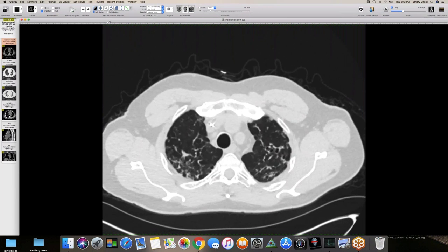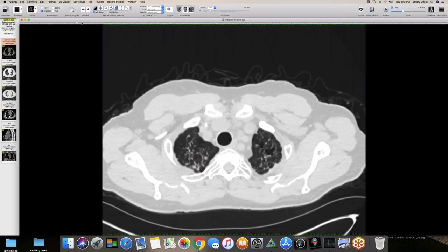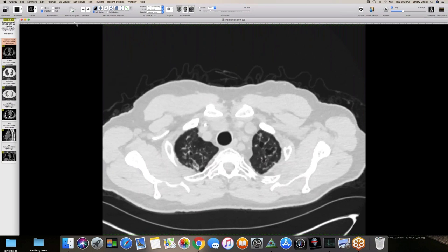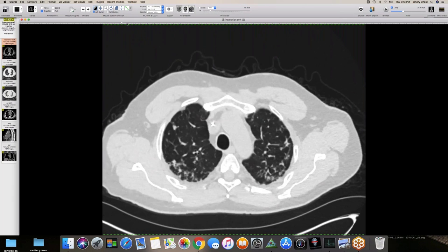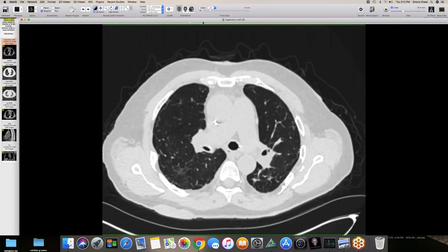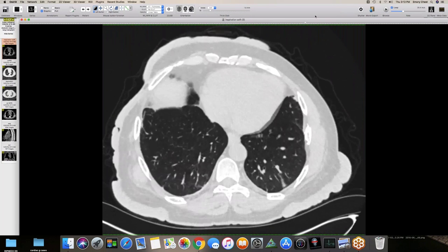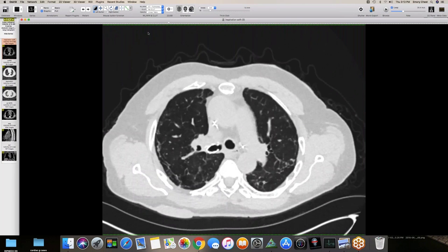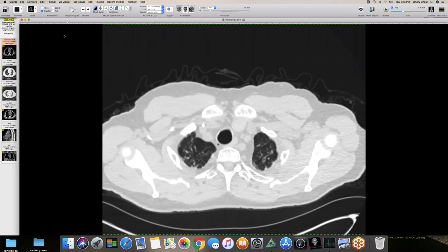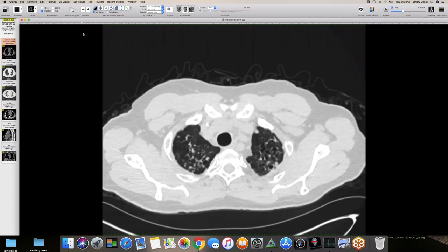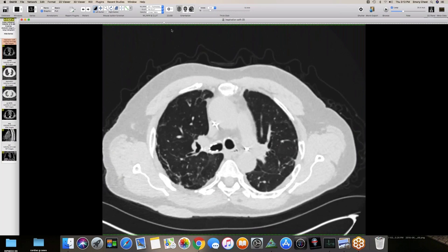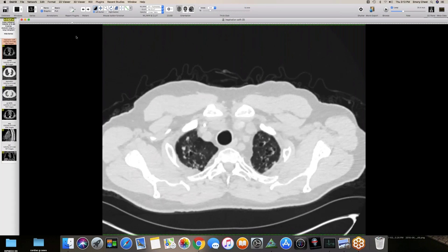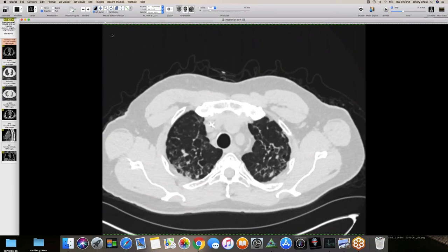Upper lobe fibroelastosis is probably RAS. It's more of a restrictive appearance than an obstructive bronchiolitis obliterans appearance of rejection. So that's a good case of two different things.